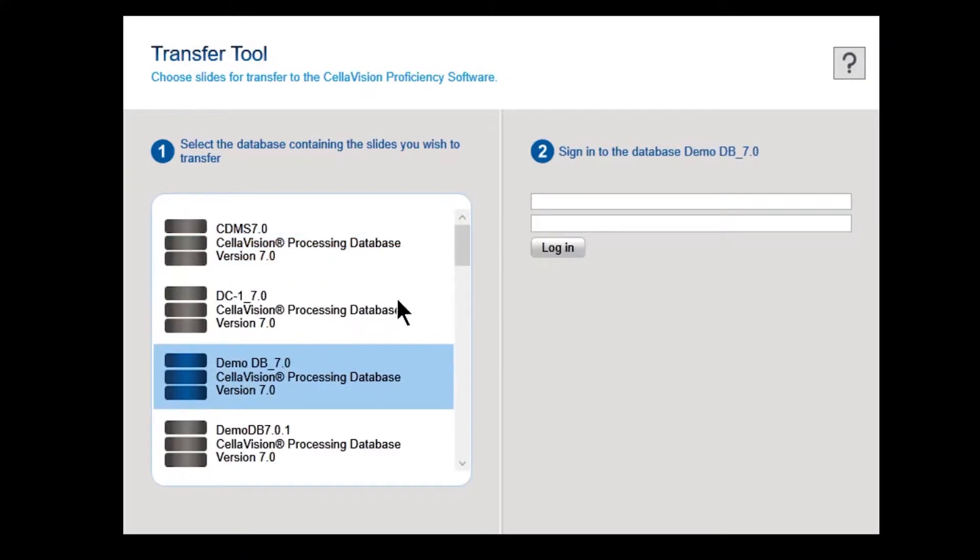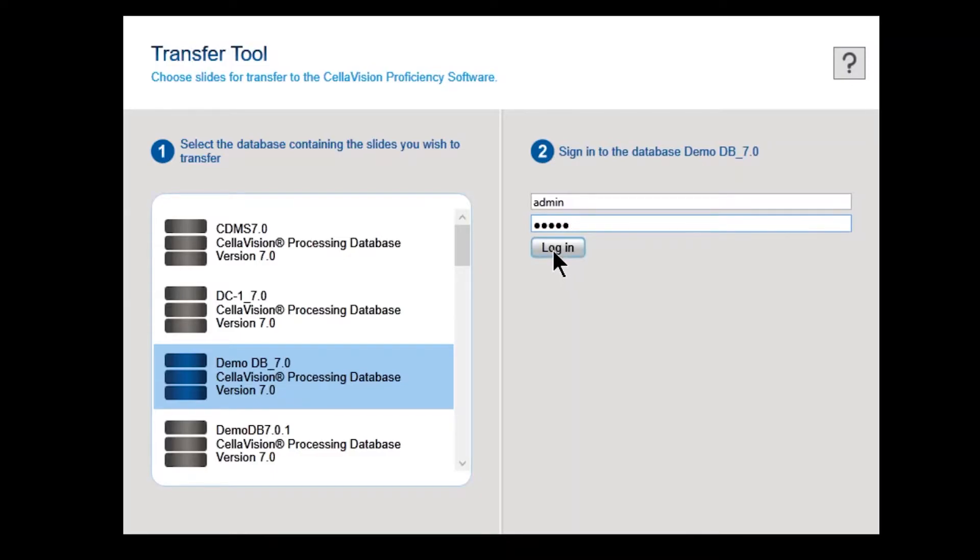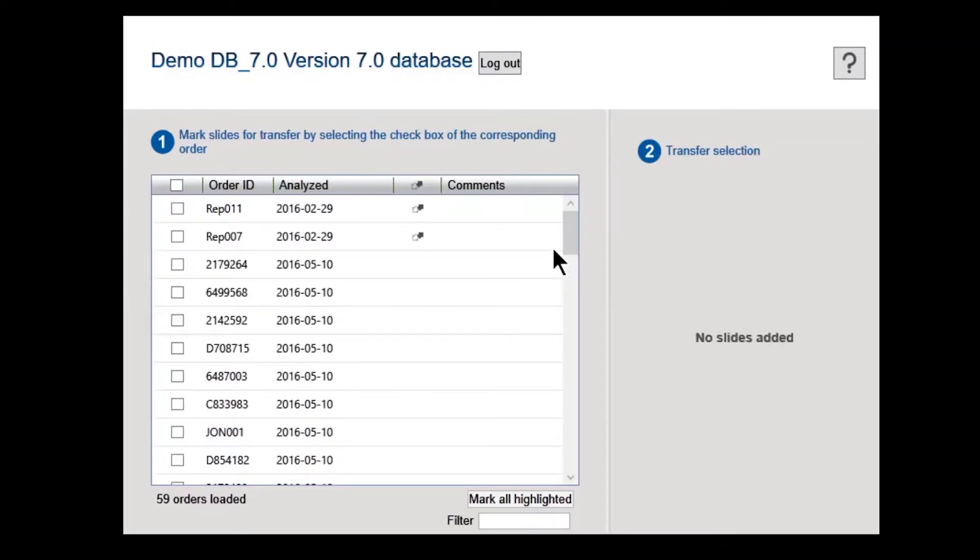Once it is open, you will see a list of all available databases. Select the database containing the slides you want to transfer and use your CellVision software credentials to log on.